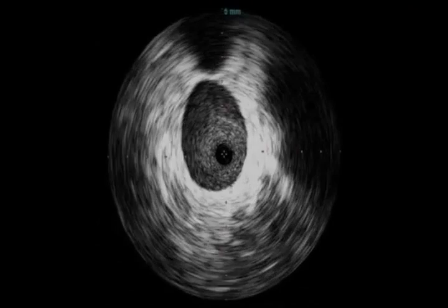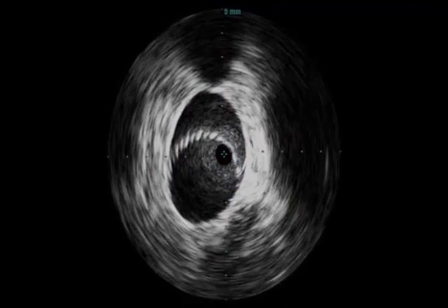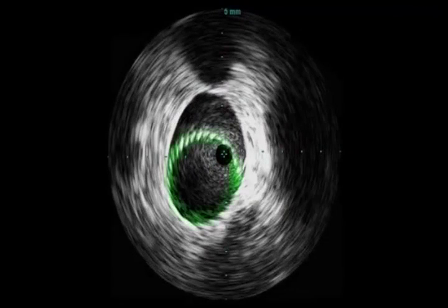This is back to the intravascular ultrasound image. This is the inferior vena cava. It's big, and the stent is a round circle here. You can see that the stent does not reach the other wall. That means that it's just extending into the inferior vena cava without completely blocking the other side, so we're not jailing the right common iliac vein.